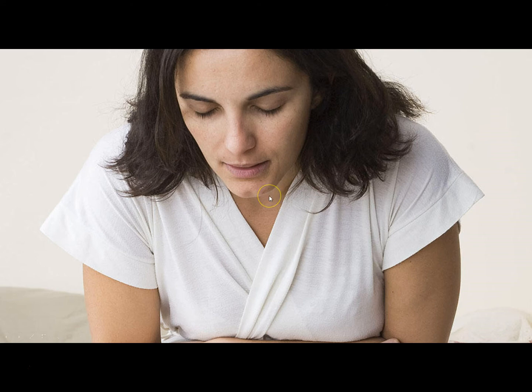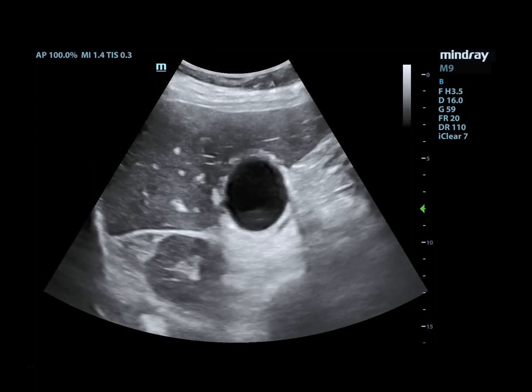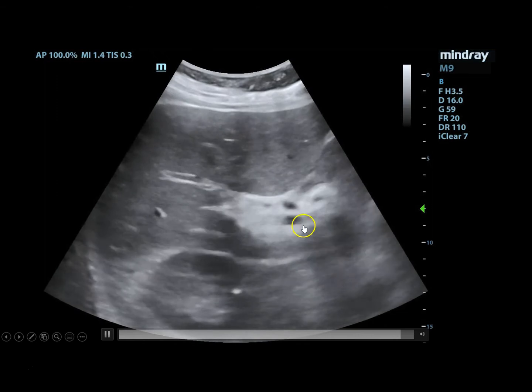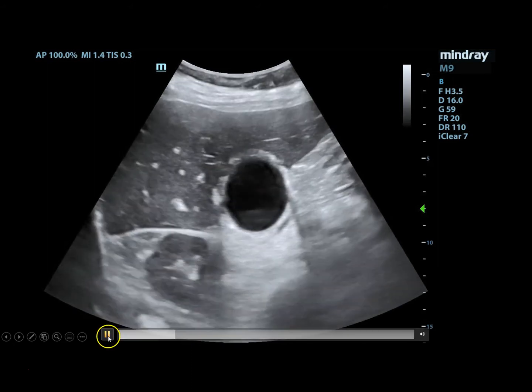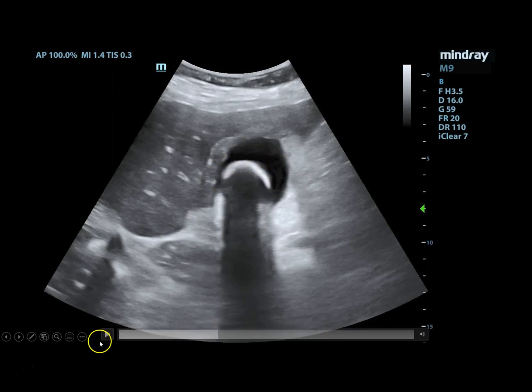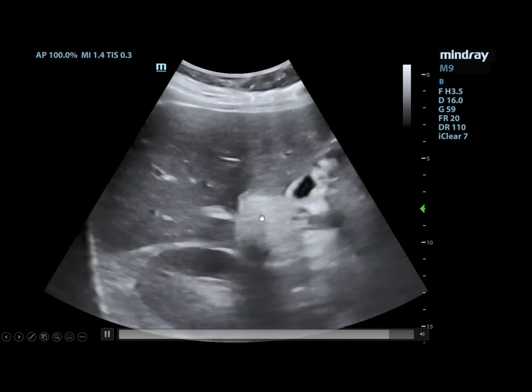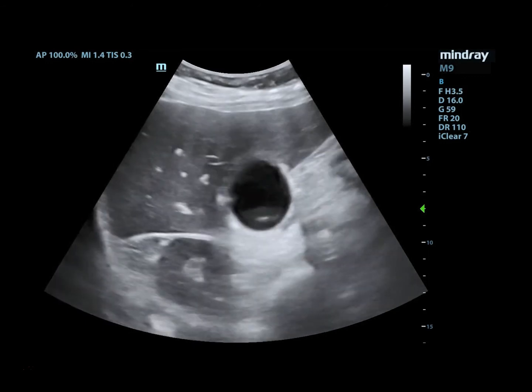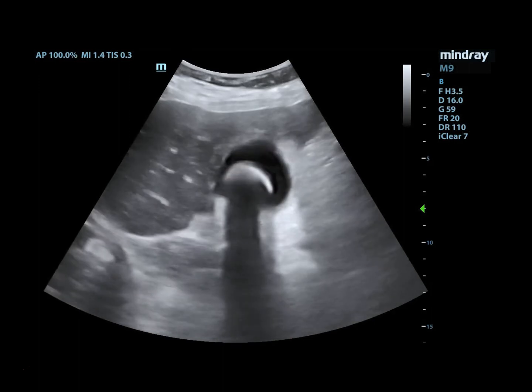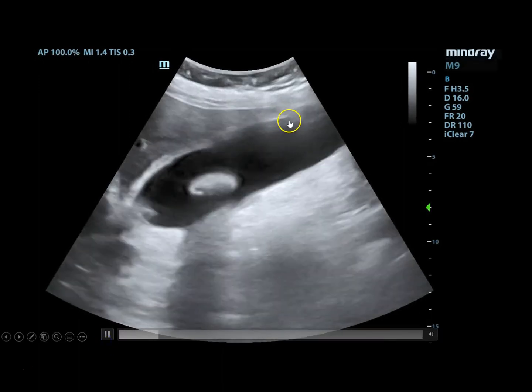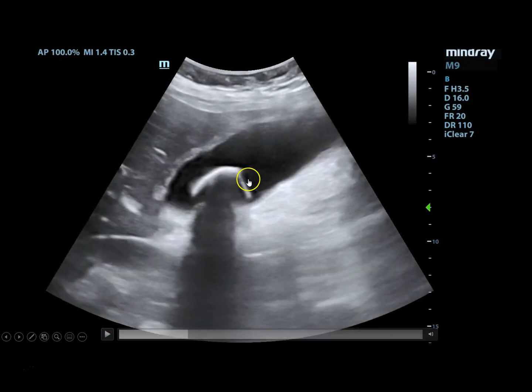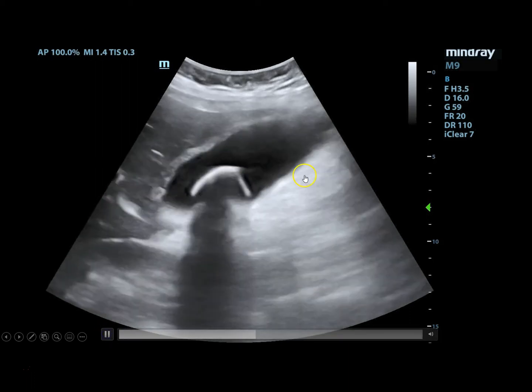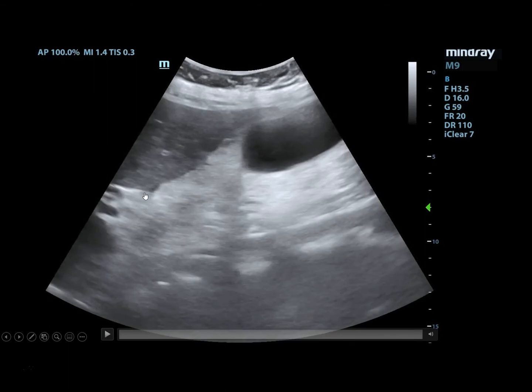A young woman complaining of severe right upper quadrant pain undergoes a quick bedside ultrasound. In the short-axis view, unlike last time where the lumen looked anechoic, there's a bright structure causing shadowing — a giant gallstone. In the long-axis view, you can see the gallstone that is bright and shadowing. Sweeping all the way to the neck, there is no pericholecystic fluid — fluid around the gallbladder — which would be concerning for cholecystitis.